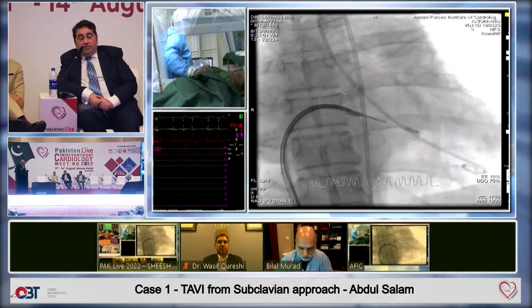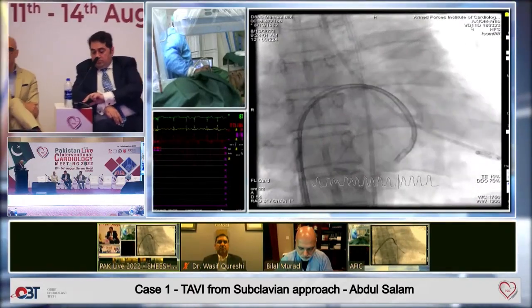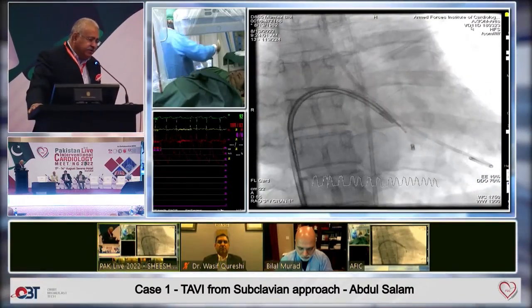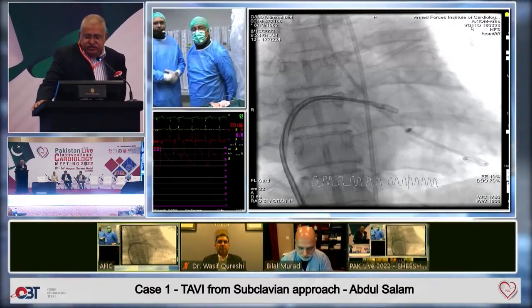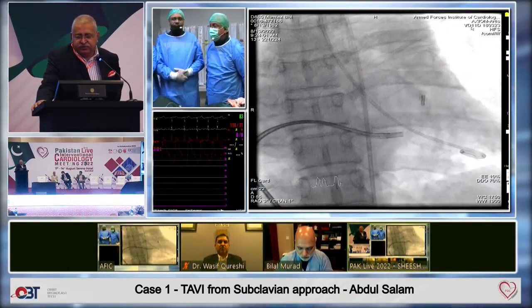So, you remember? Sorry. Yeah. We have to switch to another lab of the AFIC, where Sohail Aziz is doing a PTMC. Are we connected? Assalamu alaikum, Sohail Sahab. How are you? Yeah, we can hear you.